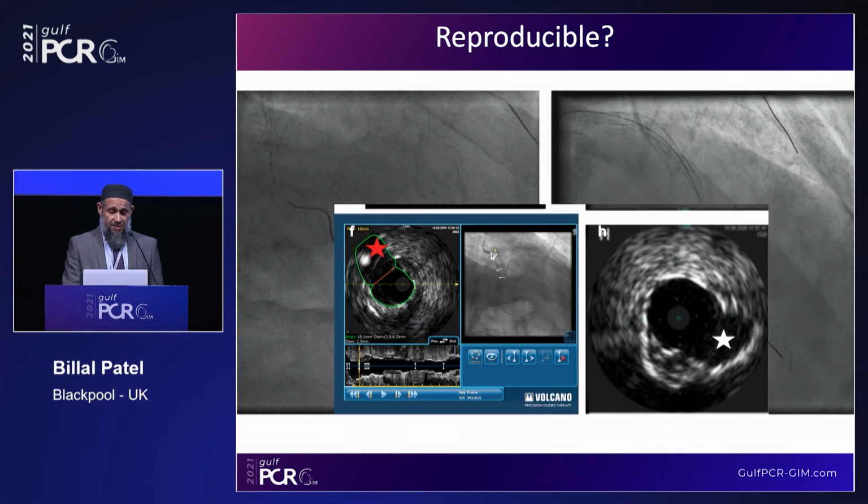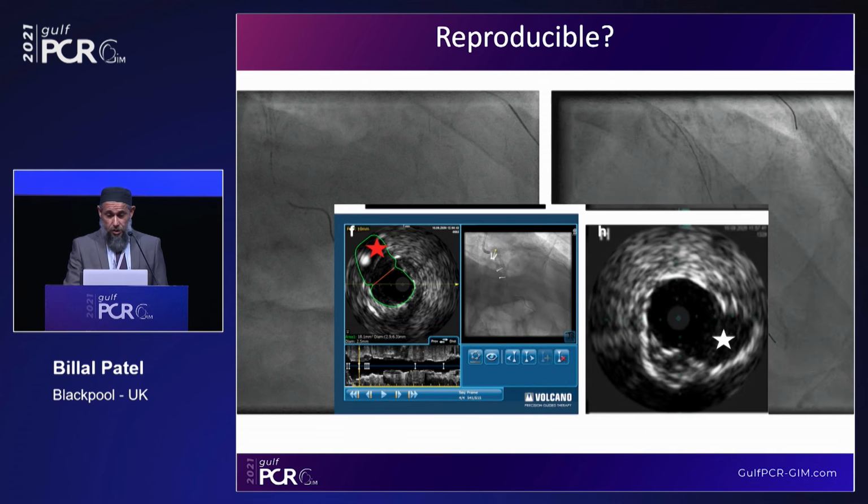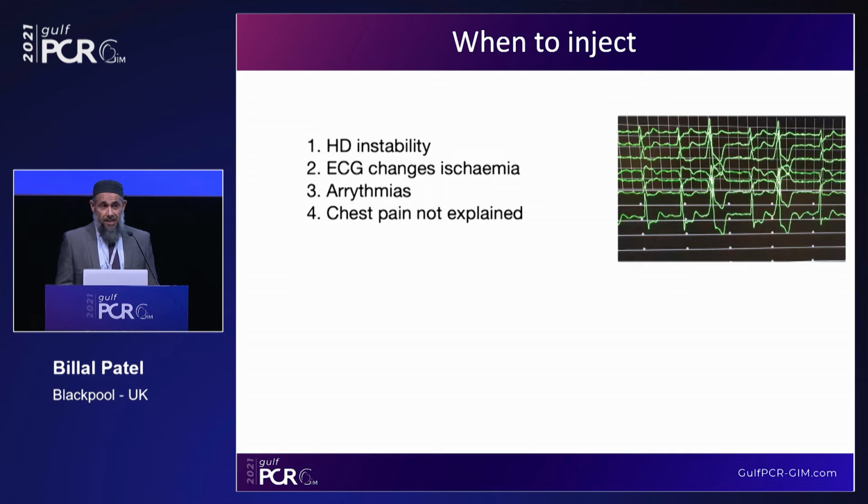And this was the IVUS looking, again showing good clearing of the struts. So when do you need to inject? This is not about how low can you go. You have to be safe.